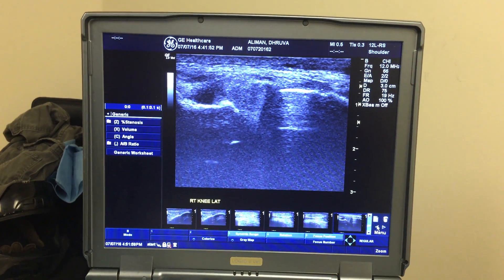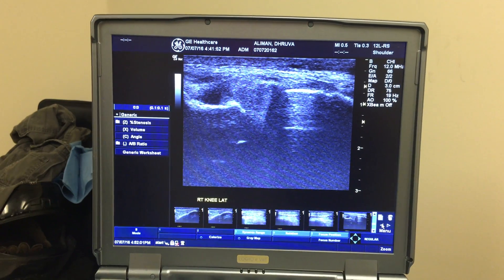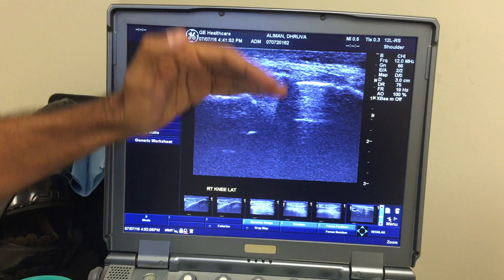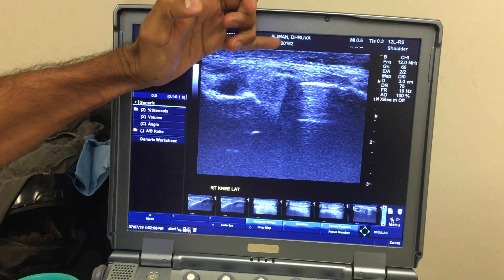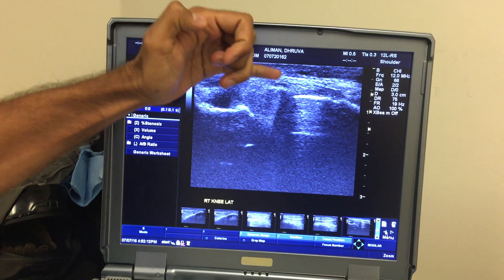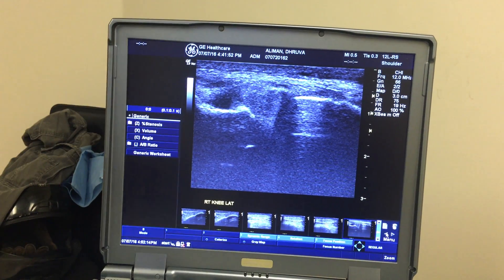The bump you have when you're standing — that's your LCL, and it's swollen. So you kind of have two bumps. One is more interior, meaning it's below the skin surface because it's not as swollen. Your LCL, which is higher, is swollen from there up to the skin, which is why you can see it visibly.